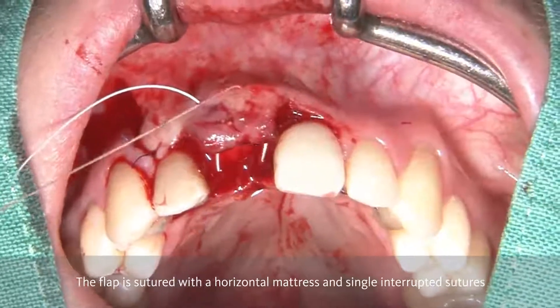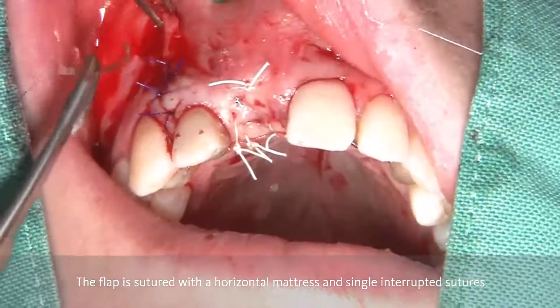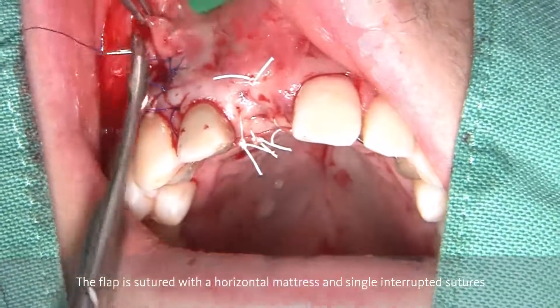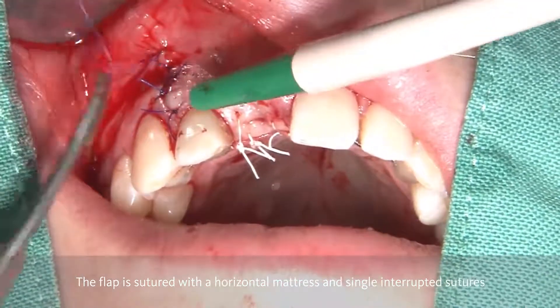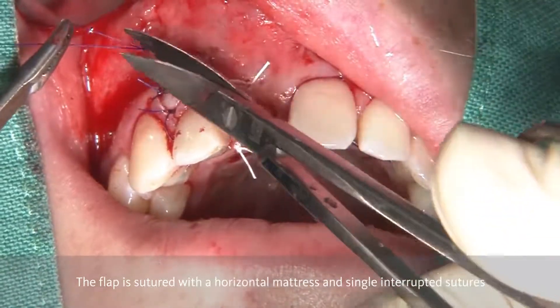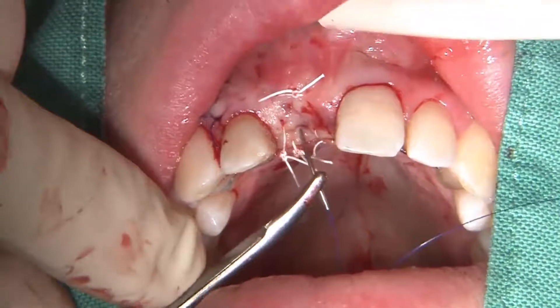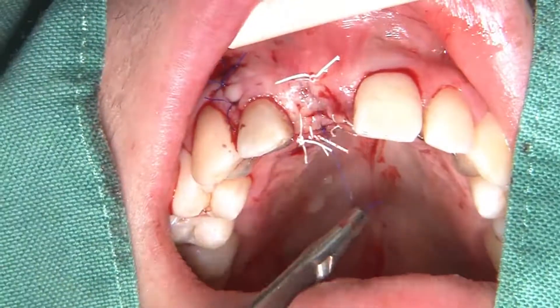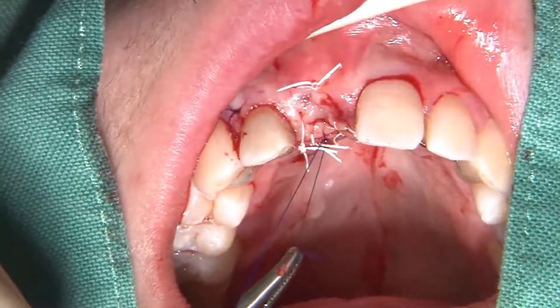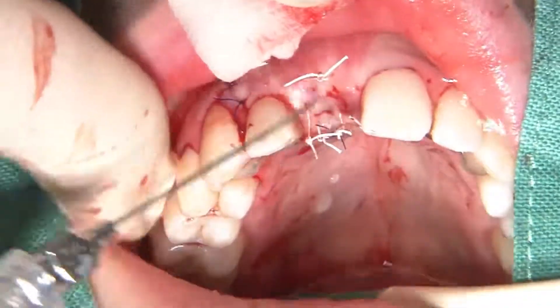You can see here the horizontal mattress being performed. Like this, we bring the wound margins passively together. Then we complete the entire suturing area by having further single interrupted sutures on top of the crest and in the area of the vertical releasing incision. Sometimes you additionally add a 5-0 or 6-0 suture to complete the crestal incision in order to have a perfect adaptation of the wound margins. And like this, we end up with a very passive suture where we have a lot of volume exactly in the area where it is most important — in the area where the future crown margin will be positioned.